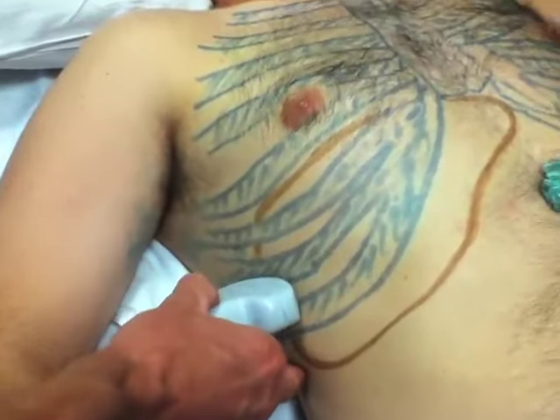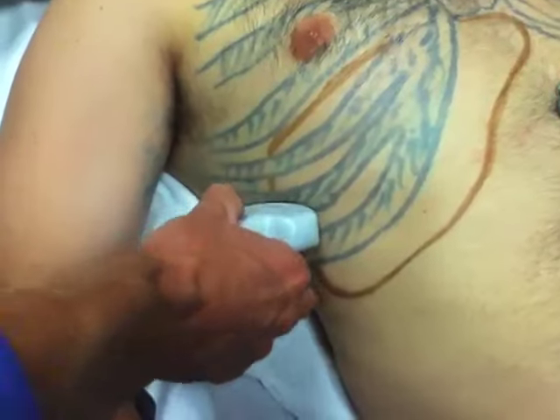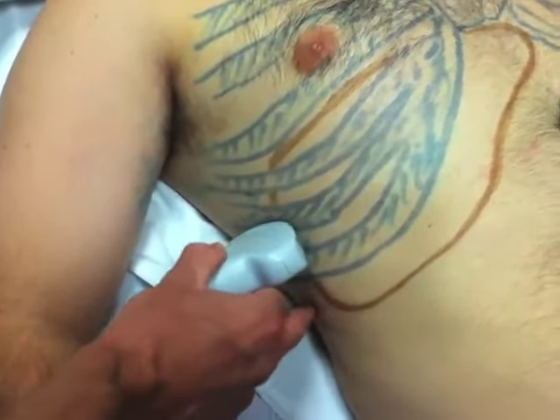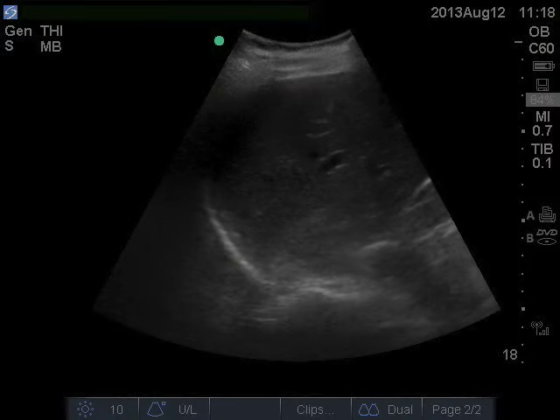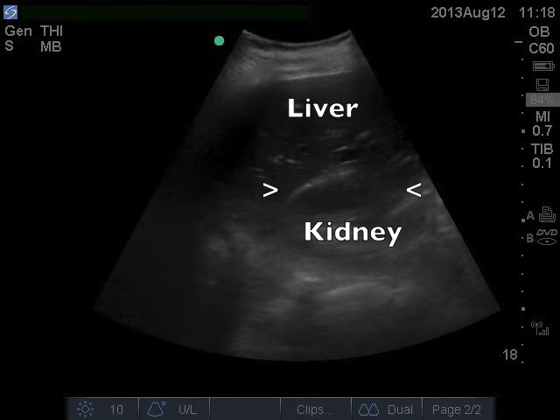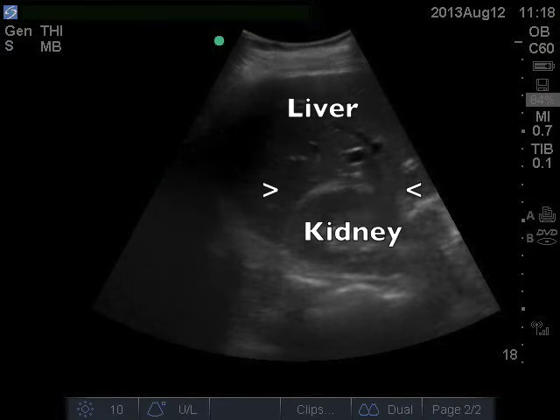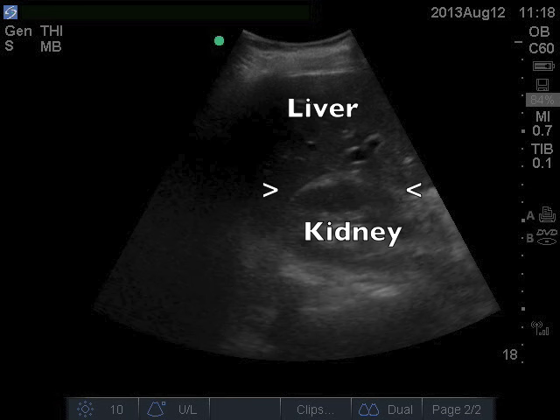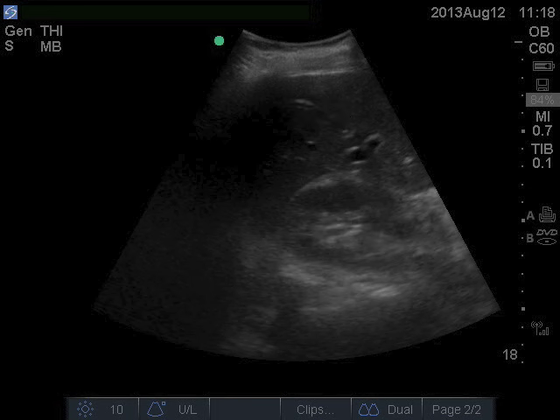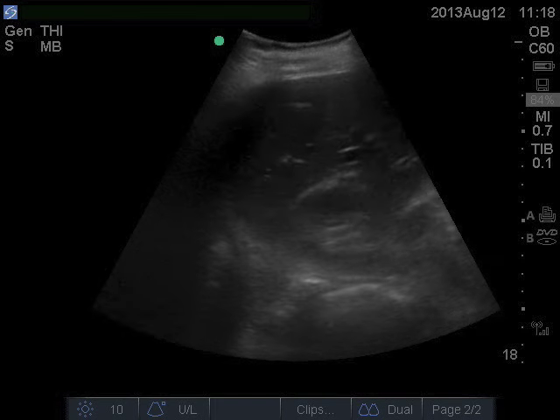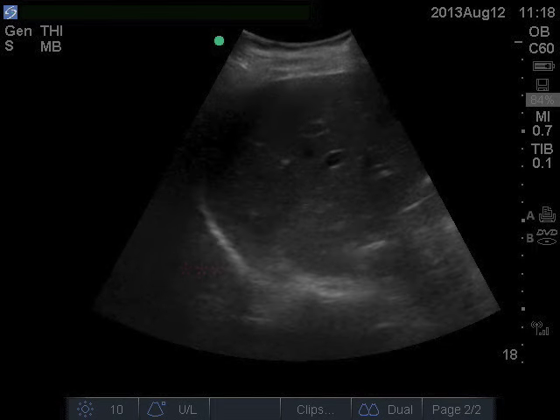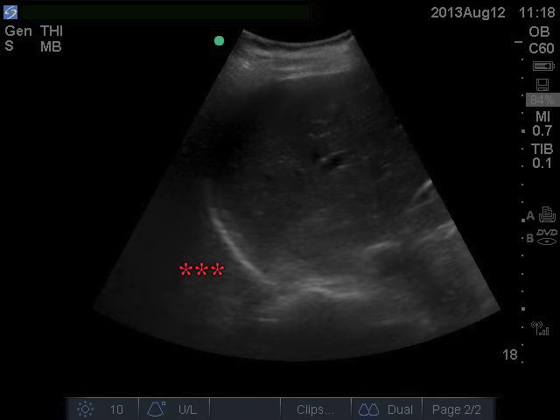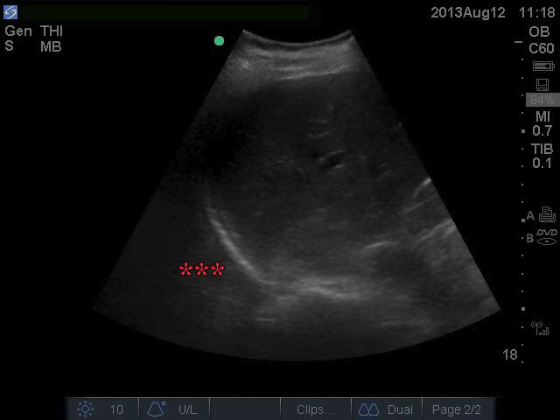From here, you can rock the probe up or down, left or right, until you see what you're looking for. Here is Morrison's pouch — the space between the liver and the kidney. There may be some adipose with a gray tint in this area, but there should be no dark black stripes, which would indicate free fluid. Be sure to angle your probe above the diaphragm and look for pleural fluid, which would be black and presumably hemothorax in the trauma patient.